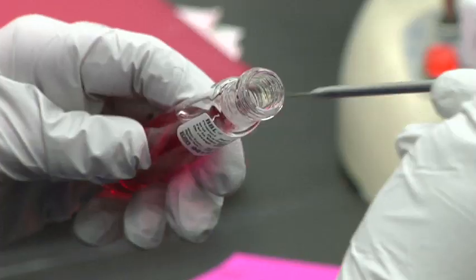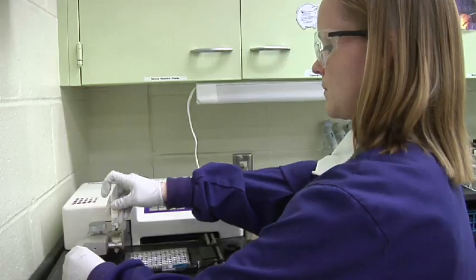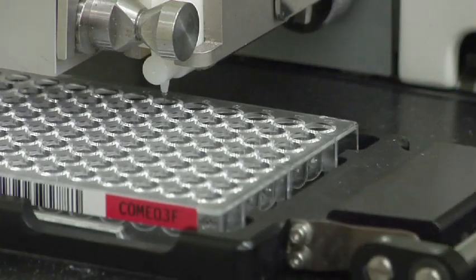Specialized testing currently includes Mycoplasma, Campylobacter and Listeria cultures, as well as ELISA-based detection of Clostridium difficile and perfringens.